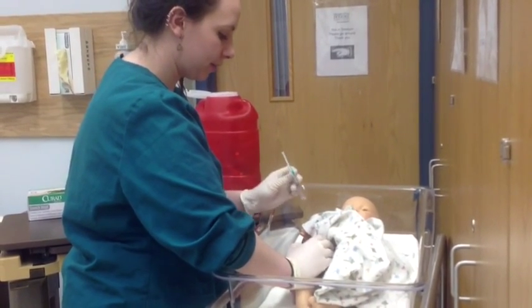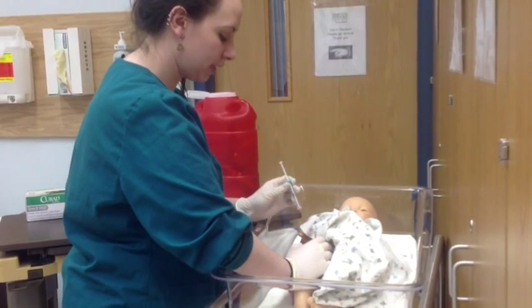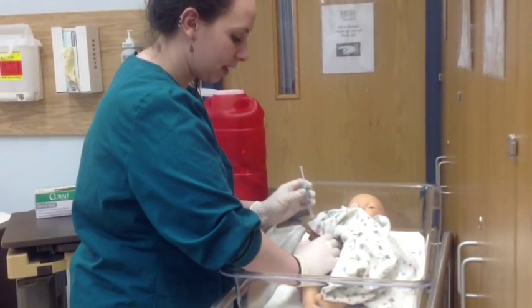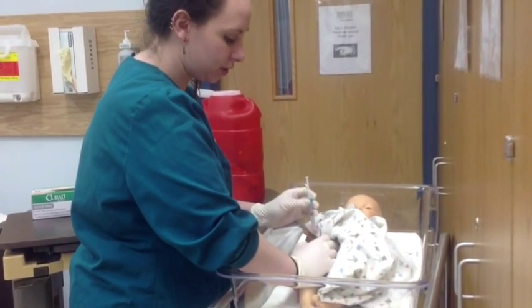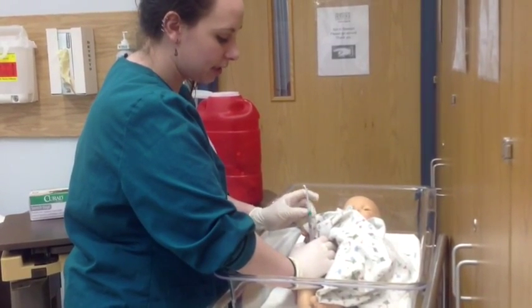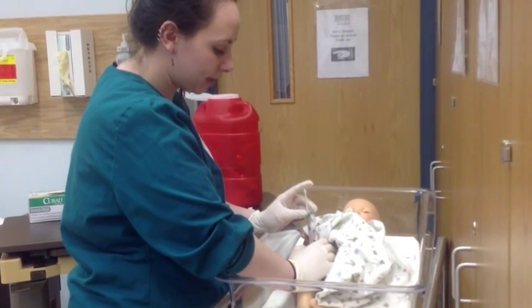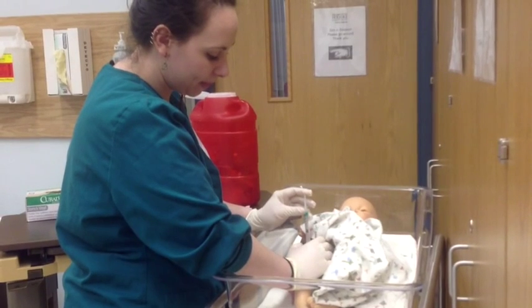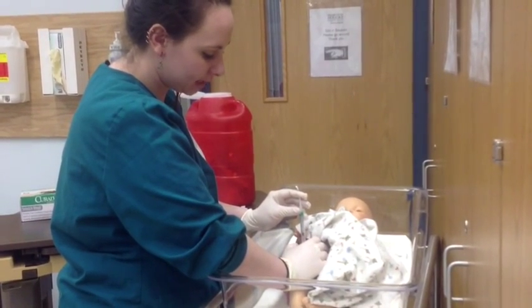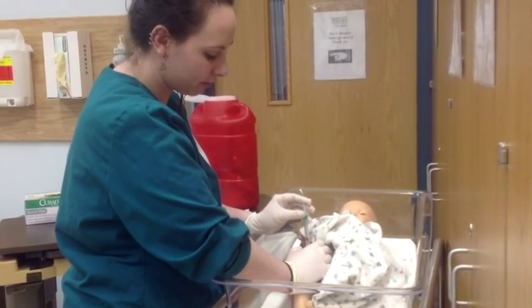Okay. You're going to make sure you have your spot all set up. You're going to hold it like a dart. You're going to go in at a 90-degree angle, nice and firm. 1, 2, 3. And this is a vaccine, so you're not going to aspirate, but you're going to push down the needle nice and slow. If you go too fast, it can cause more pain and discomfort.